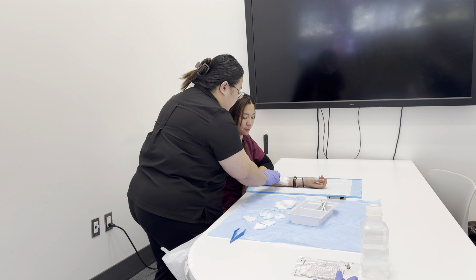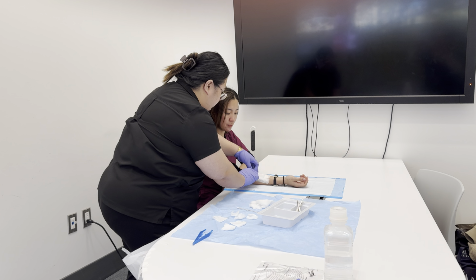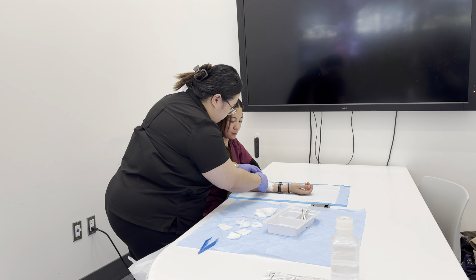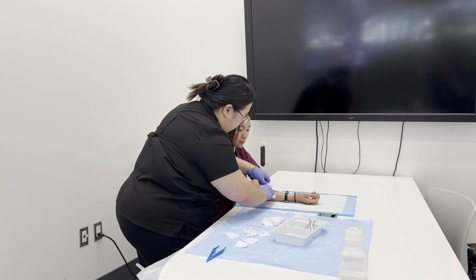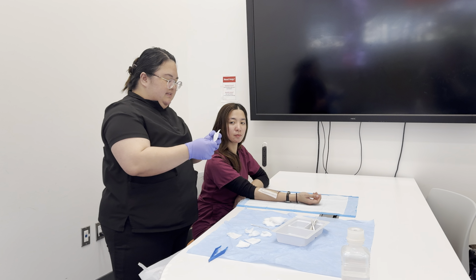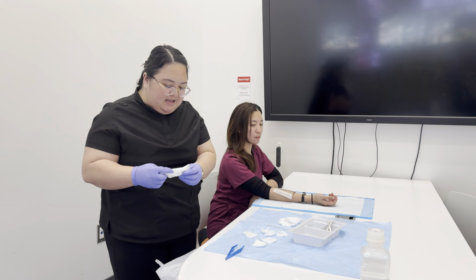I will now remove the dressing. Make sure that you remove it gently. So as I can see, the dressing is mildly soaked with serosanguinous drainage and the dressing is still intact.